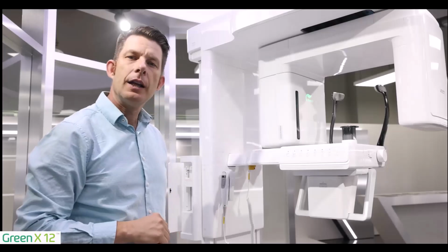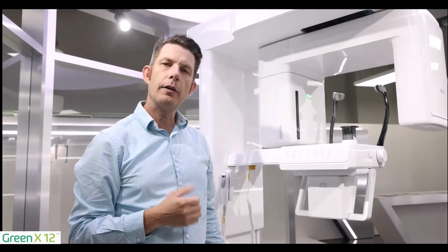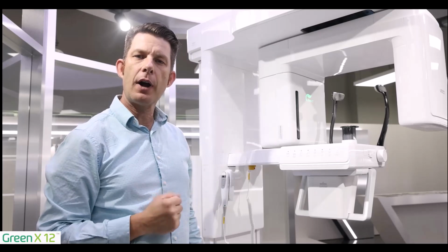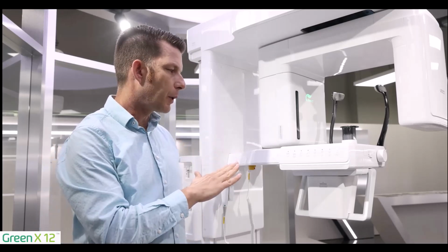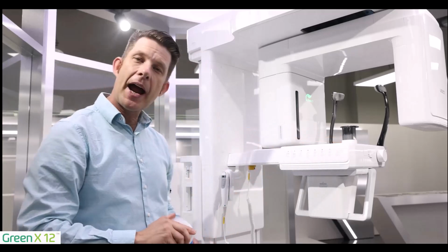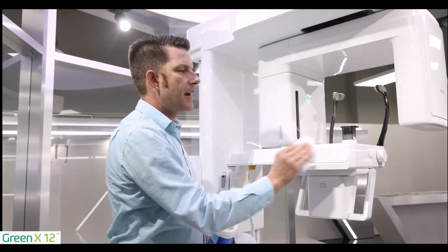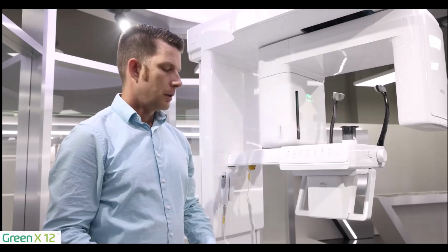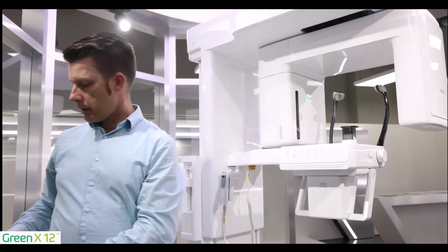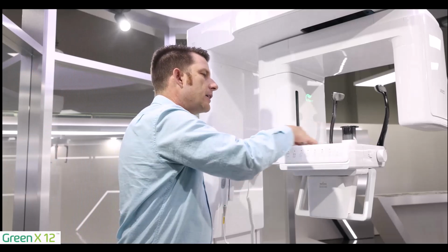All right, let's go ahead and look at cleaning and care for the device. With cleaning and care, you want to use a hydrogen peroxide based wipe. We do not want to spray on the device, but just use a hydrogen peroxide based wipe to wipe off the areas. So I've got my hydrogen peroxide based wipes here. We're going to wipe the device down. We're going to go ahead and grab a dry cloth and then dry that area off.